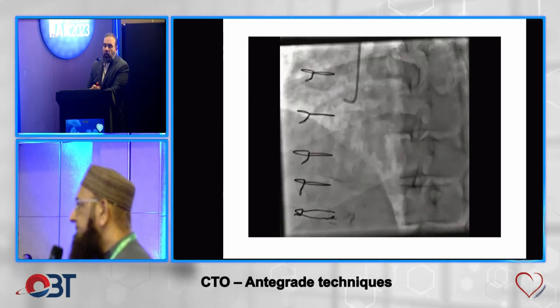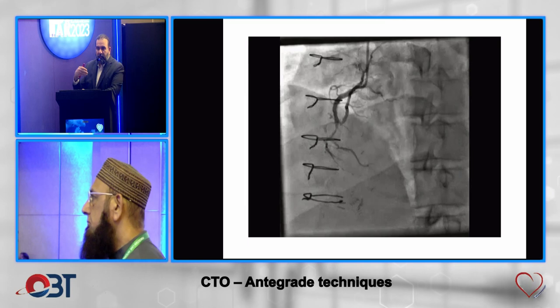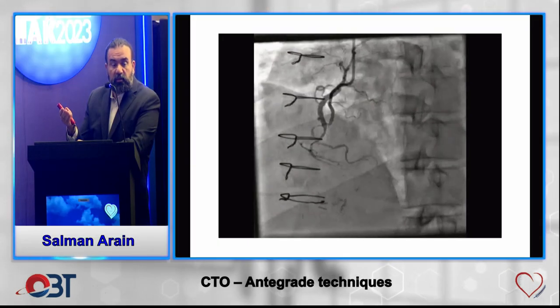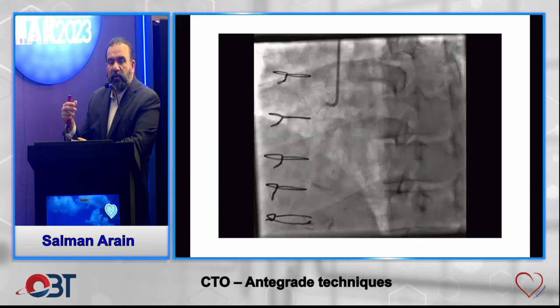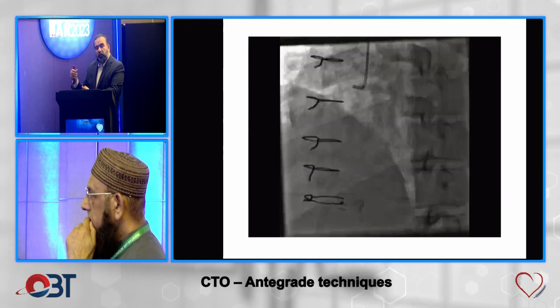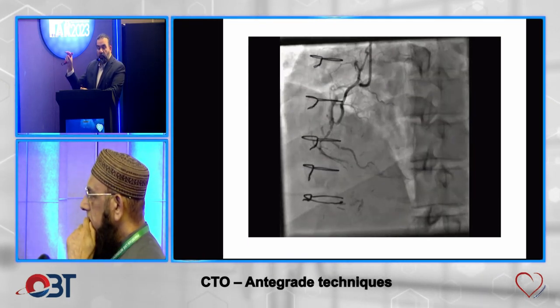Excellent. So I think for a microcatheter you need flexibility and torqueability. So Corsair and Turnpike are good catheters to torque. Fine Cross could also be used, but you can't rotate it, because once the wire goes across, you want to be able to rotate the catheter because you're not getting as much support from the guide.